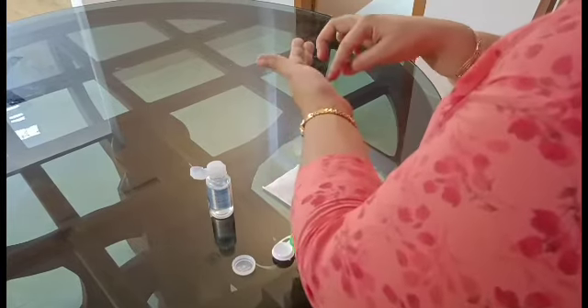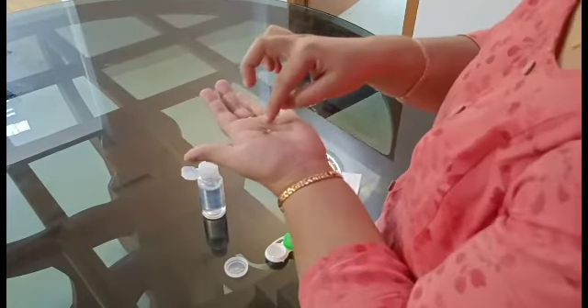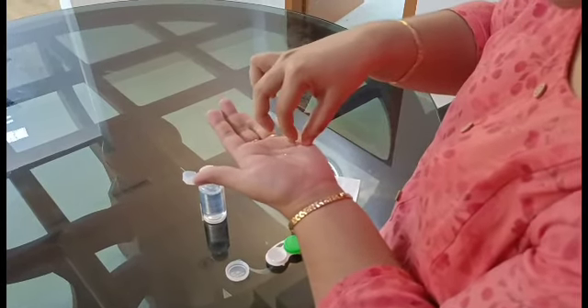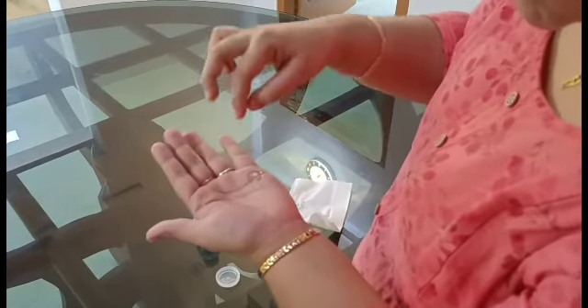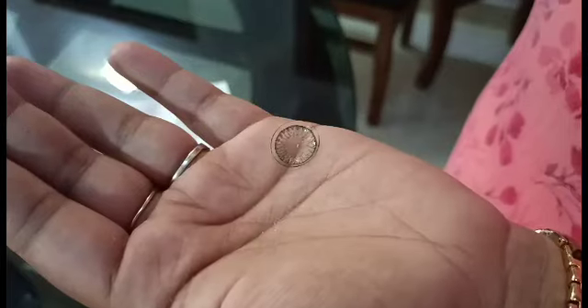Dry off the back solution. Place the lens in the correct position and check it in the solution. We will take the TACO test to verify the lens is the right way round before insertion.